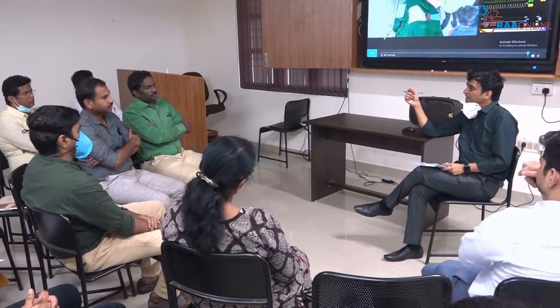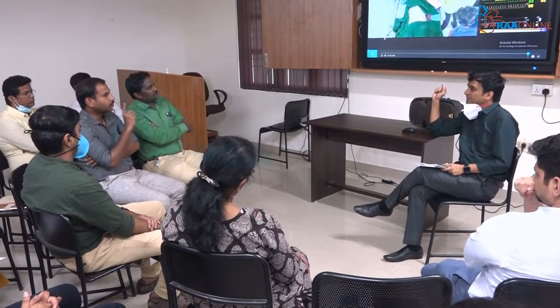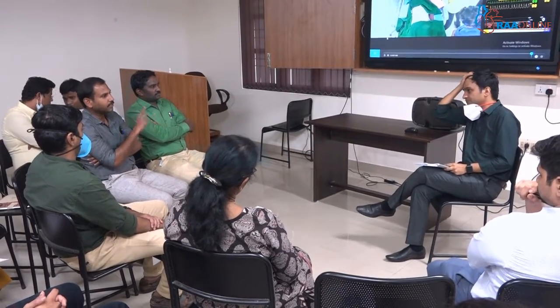Alright. What is your take home message from this scenario? One more thing is, with an obese patient with a history of snoring, I will attach a nasal cannula if available, or high flow, during my induction. Since the patient is an obese patient, we should always consider a backup plan, either a supraglottic airway device or something else. So you want a backup plan, that's the final. What is your take home quickly? So we'll just finish it off with this last one.